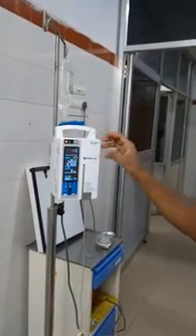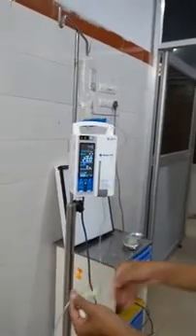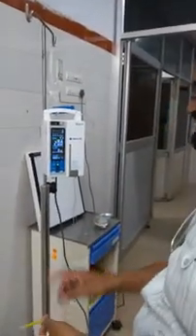So after 24 hours, this is an occlusion which is there, because I have not opened the clamp. Yes, okay, now I opened. So now it is okay, confirmed. It is done. Okay, done. So this is a very sensitive thing, and it is showing that.